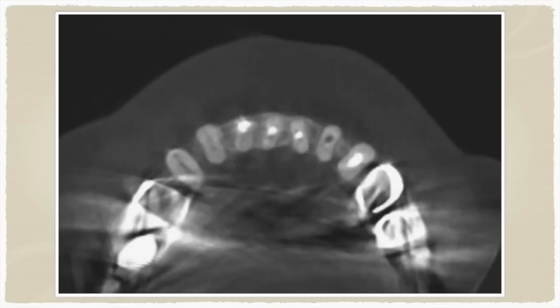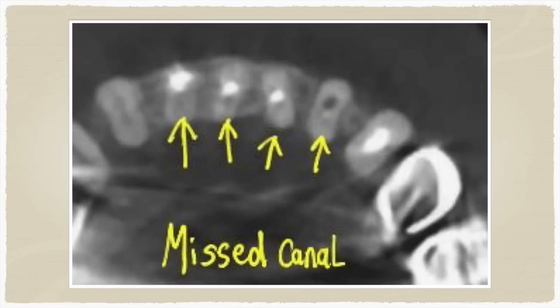On the axial section, all four incisors have root canal fillings. On the three on the left, the lingual canal has been missed. The one on the right — the right lateral incisor — it is the buccal canal that has been missed and the lingual has been filled. So in each tooth, one canal has been missed, which explains the source of the persistent infection and the problem associated with these teeth.